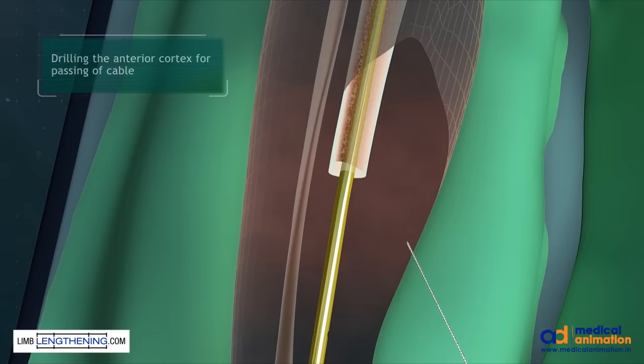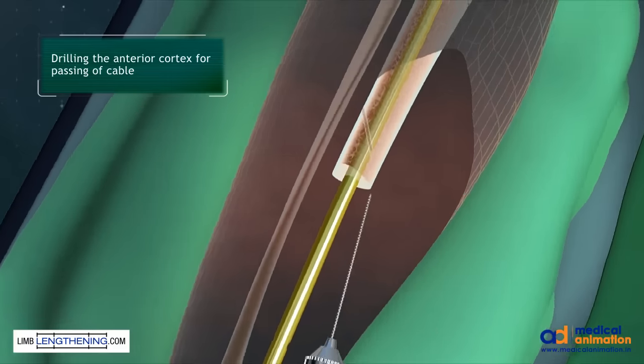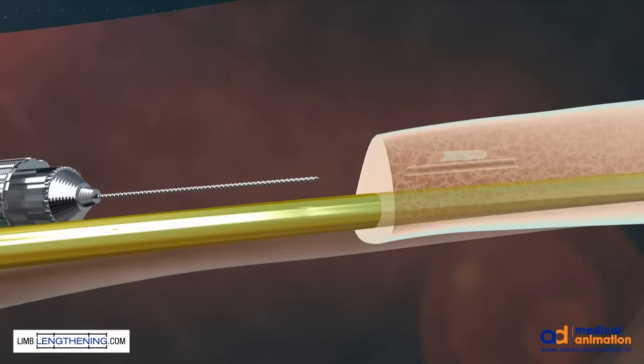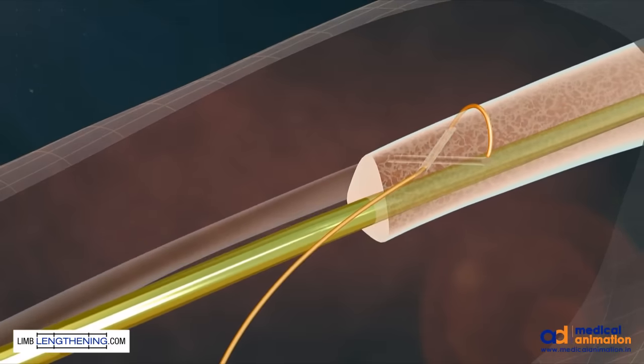The next part of the procedure is using a 2 millimeter drill bit to allow for the cables to be passed around the anterior cortex. It is important to ensure that the drill bits do not pass or cross each other, as it will make passing the cable not possible.